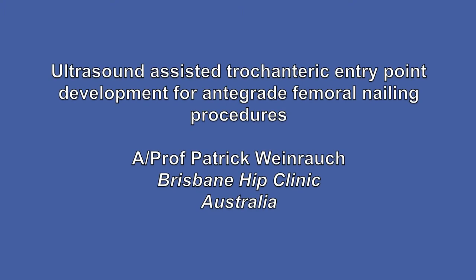This video demonstrates the use of intraoperative ultrasound for entry point development in anterograde femoral nailing procedures.